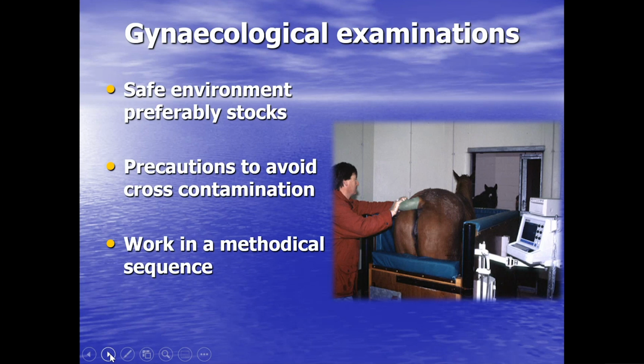Particularly poignant, I suppose, in the current time, it's a more controlled environment to allow you to avoid cross-contamination and transmitting disease around the place. So the fact you've got the mare restrained in stocks allows a much more controlled environment. And with that controlled environment, I think comes the ability to work in a methodical sequence.